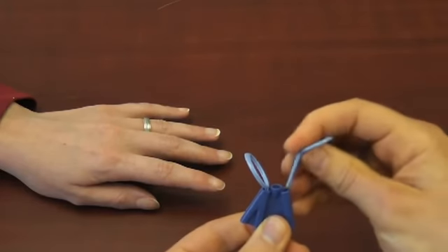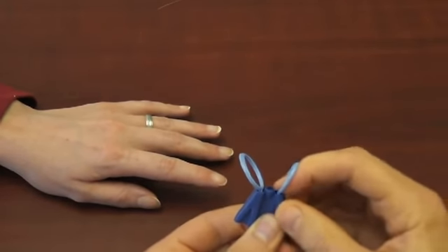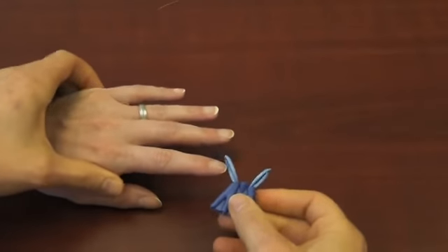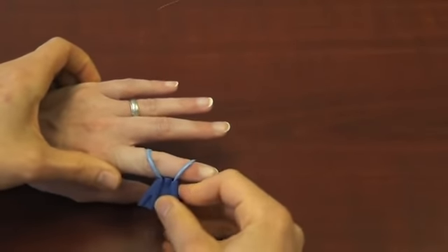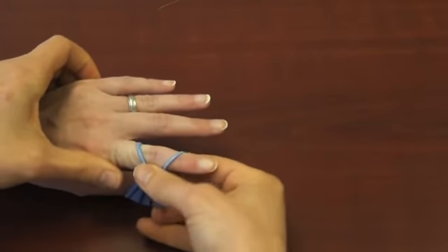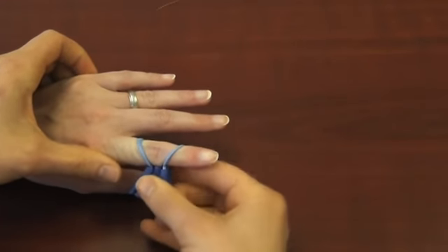Once you create a trial splint, slide the larger end on the finger first. Since the trial splint is plastic, you may need to passively correct the deviation with your hand to position the splint on the finger to evaluate the fit.